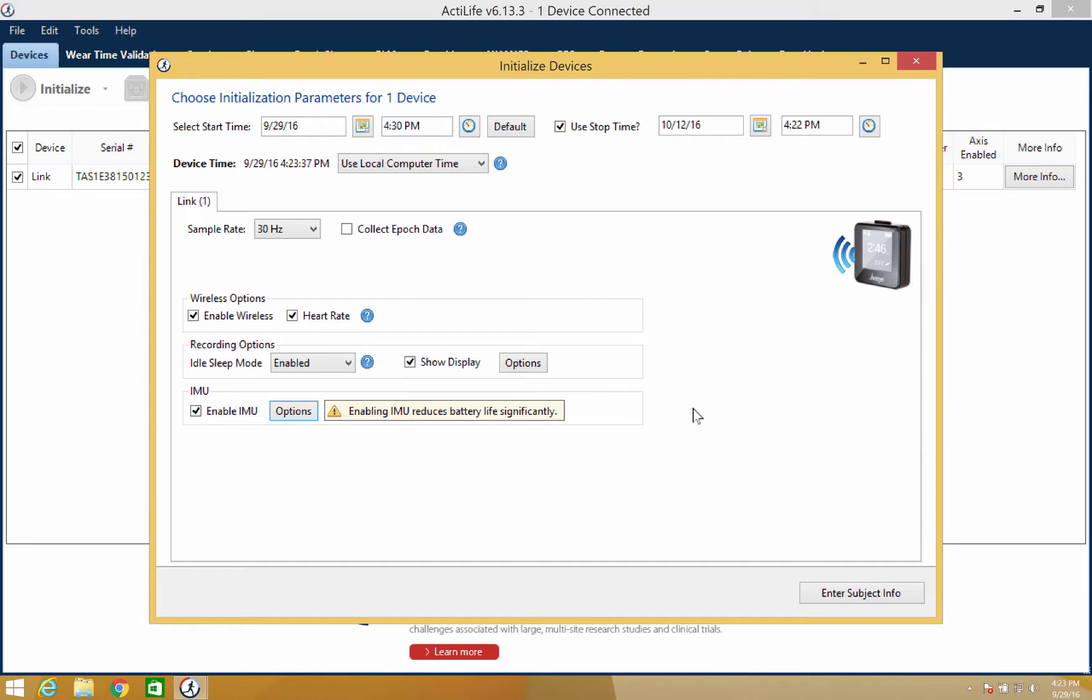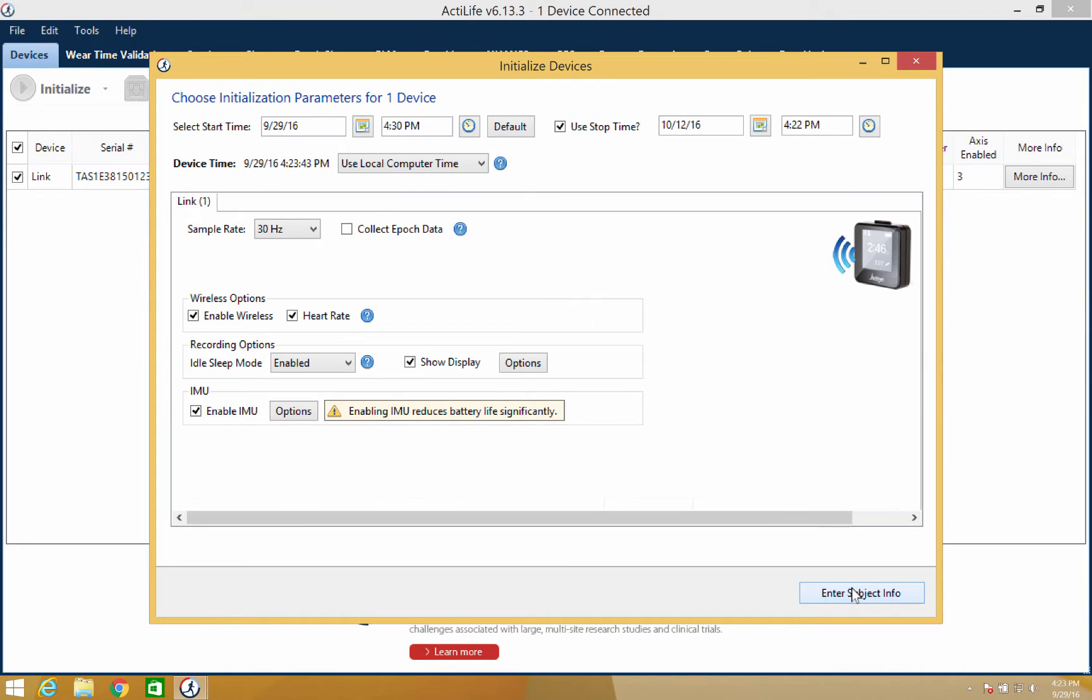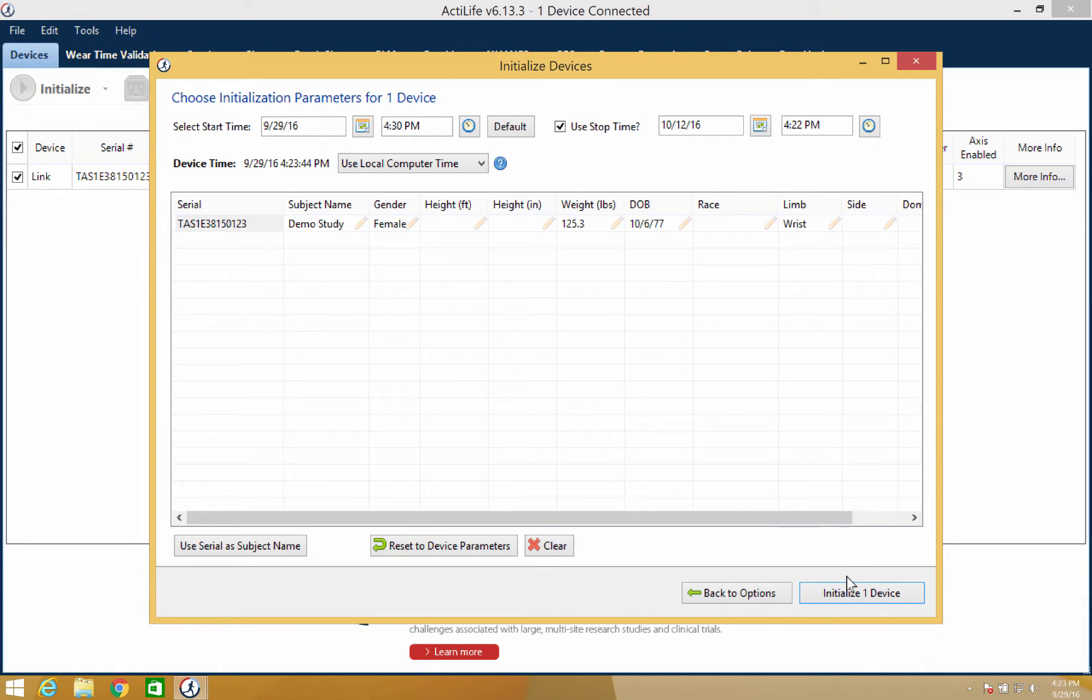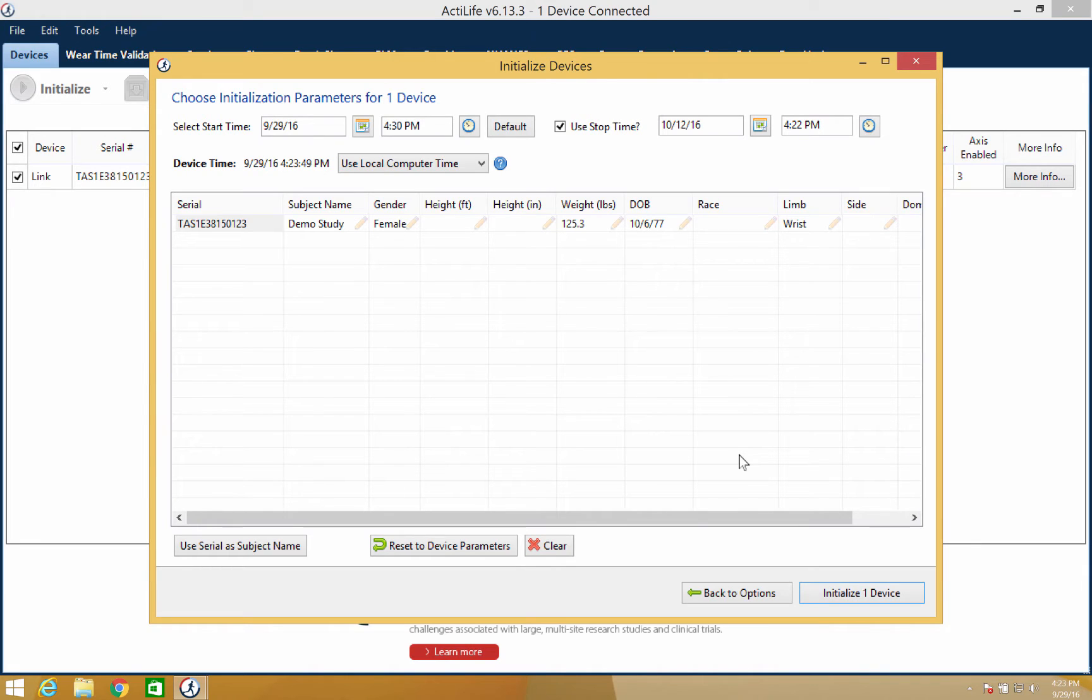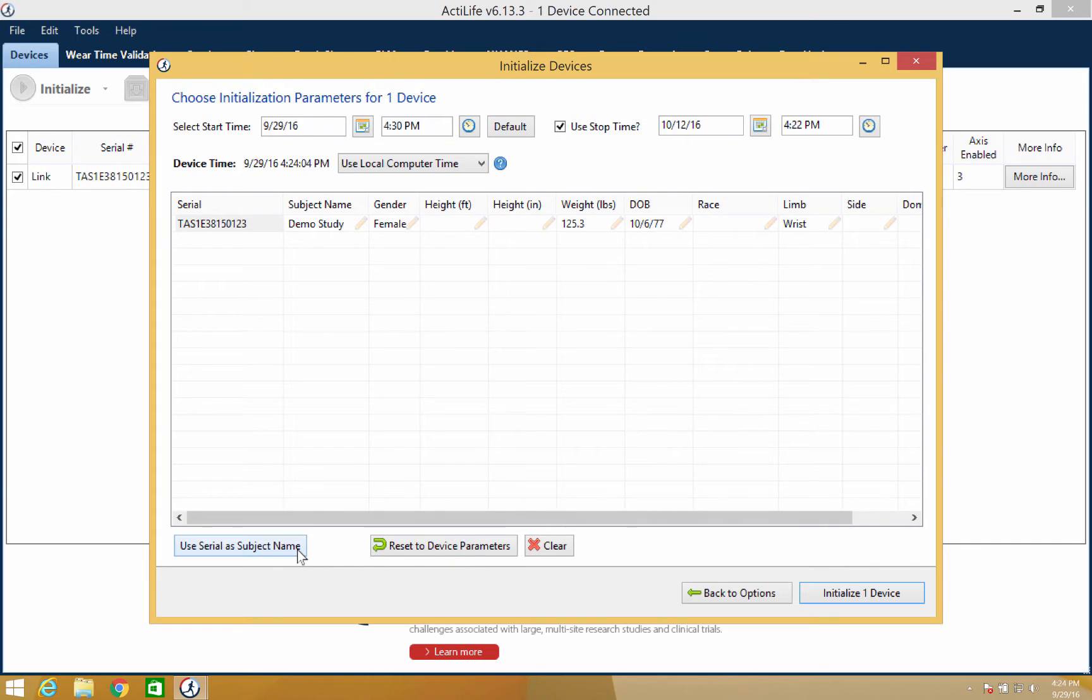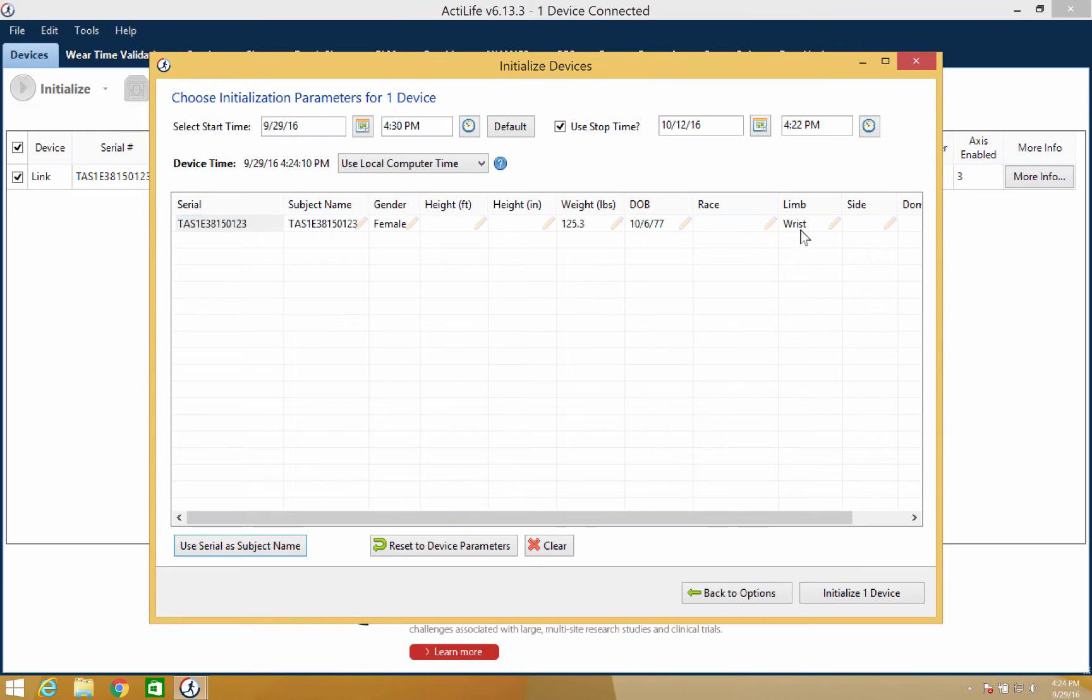Once your device's parameters are set, you can enter the subject's information by clicking the button in the bottom right corner. The subject information isn't required for initialization, but it can be entered to better manage your devices. If you choose to keep your subject's information private, the device's serial number can be used. The serial number will automatically be used by clicking the use serial number option. You will also want to select where on the body the device is being worn.